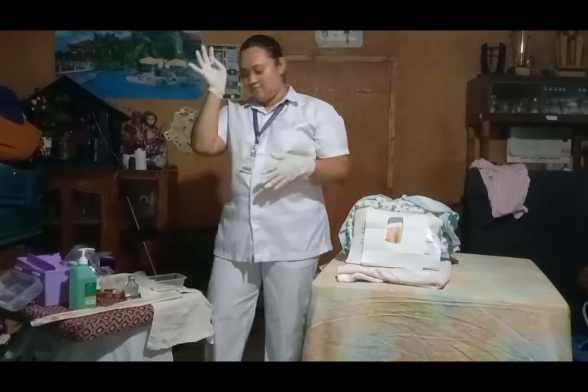So, lubricate the catheter about 1.5 inches, being careful not to plug the eye of the catheter. This is done to reduce discomfort and friction, which in turn may reduce pain upon insertion, and infection and trauma of the urethra.